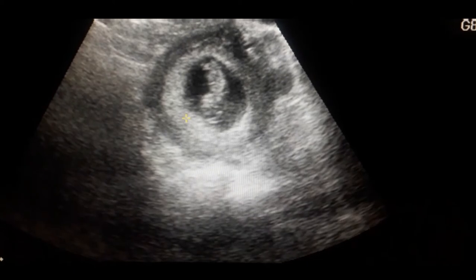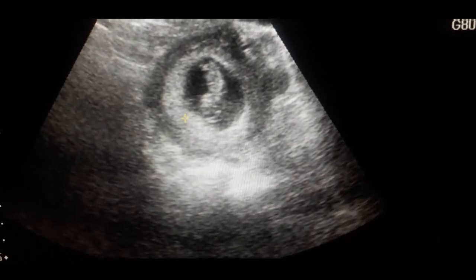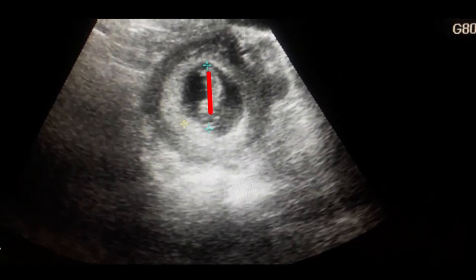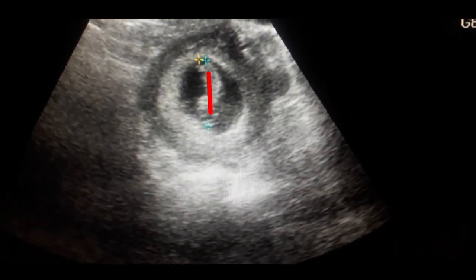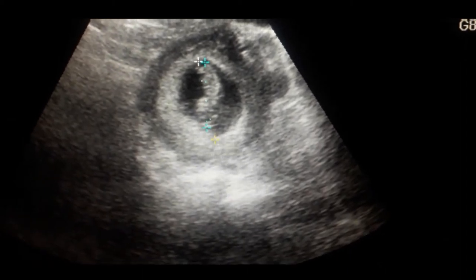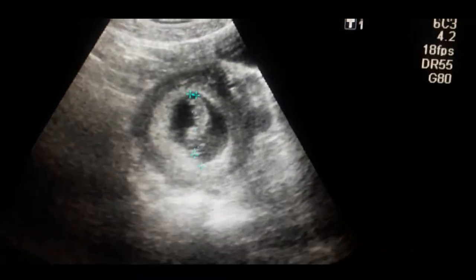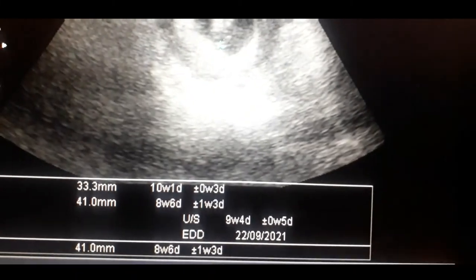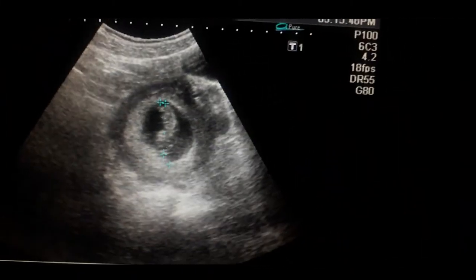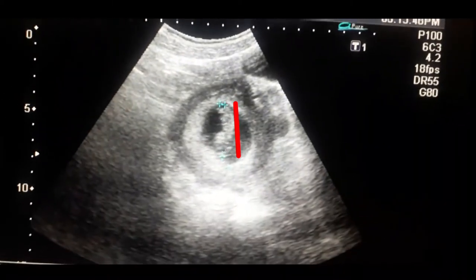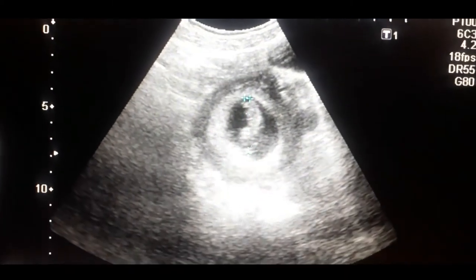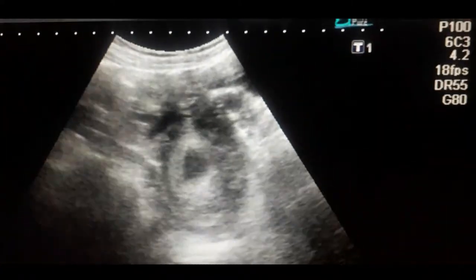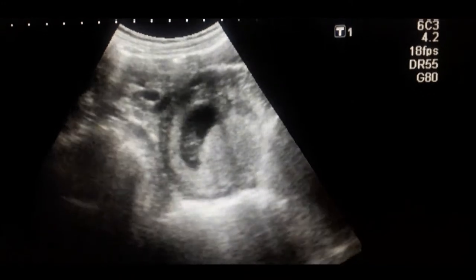Now look at the fetus. I would like to calculate the crown-rump length from one end of the fetus to the other — it is about a nine to ten week pregnancy. We also like to calculate the gestational sac. This is the amniotic cavity within which the fetus is present.